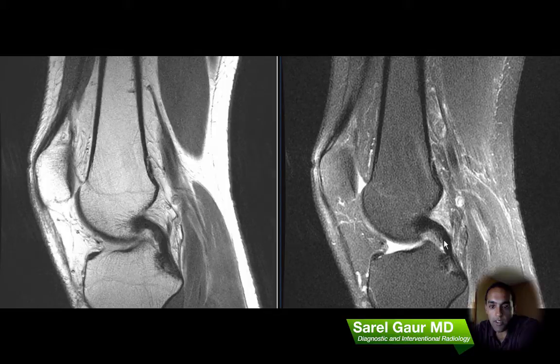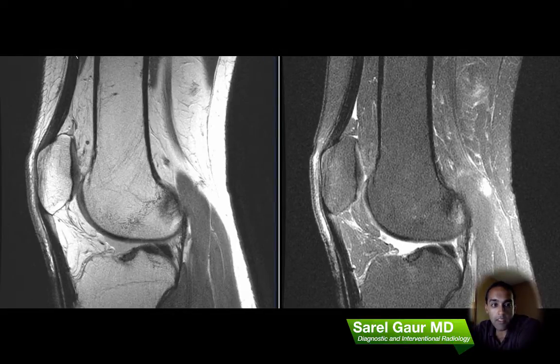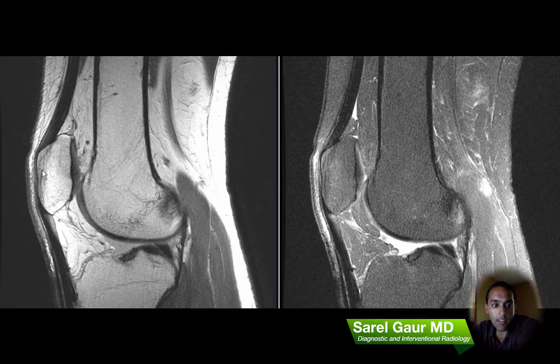No evidence of fluid or tearing on the fluid weighted sequence. So after we do the menisci and the cruciate ligaments, I then go to the extensor mechanism — basically the set of structures that become very tight when you extend the knee. Here is the quadriceps tendon inserting on the patella — no evidence of fluid or tearing on the fluid weighted sequence. And then the infrapatellar tendon is inserting onto the tibial tubercle. This is all intact and normal, no evidence of fluid or tearing.